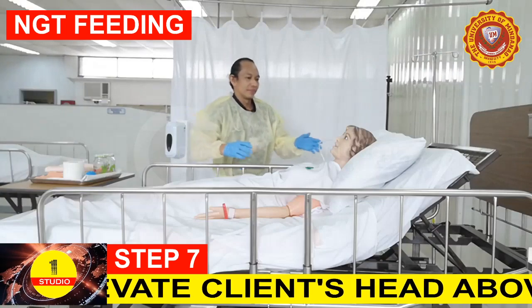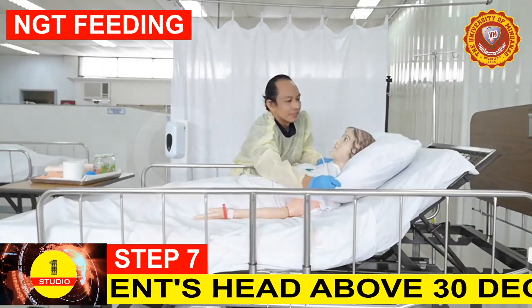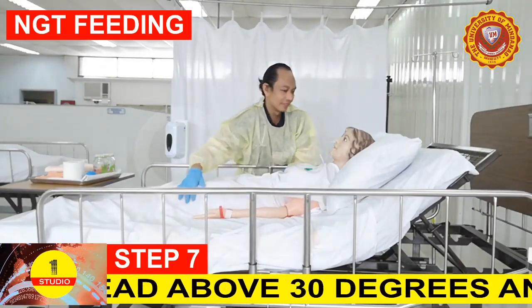Step 7. Put the client in a semi-Fowler's position or high-Fowler's position prior to feeding.